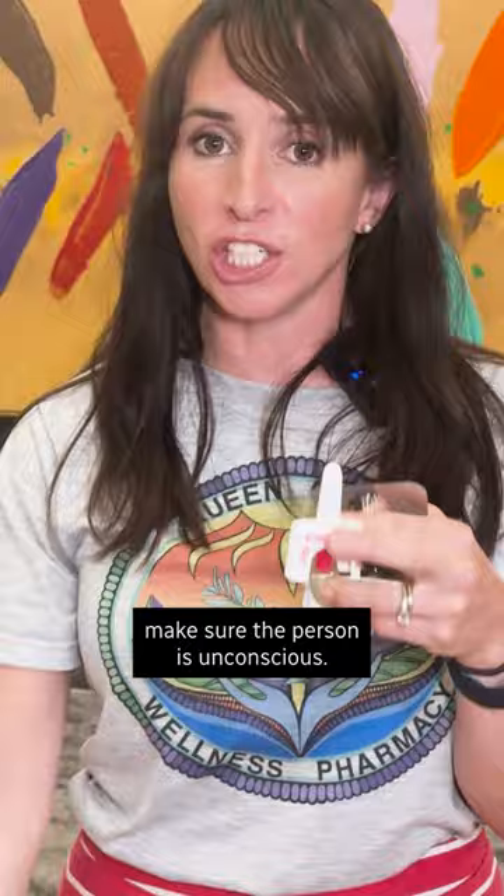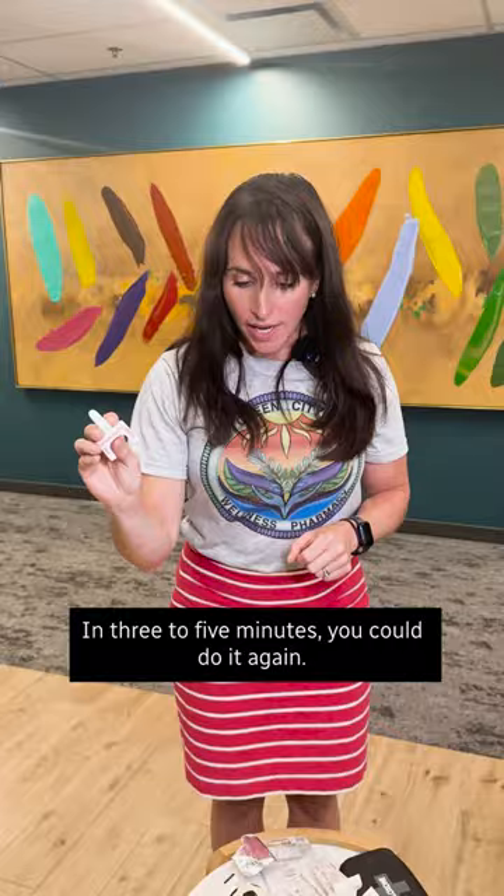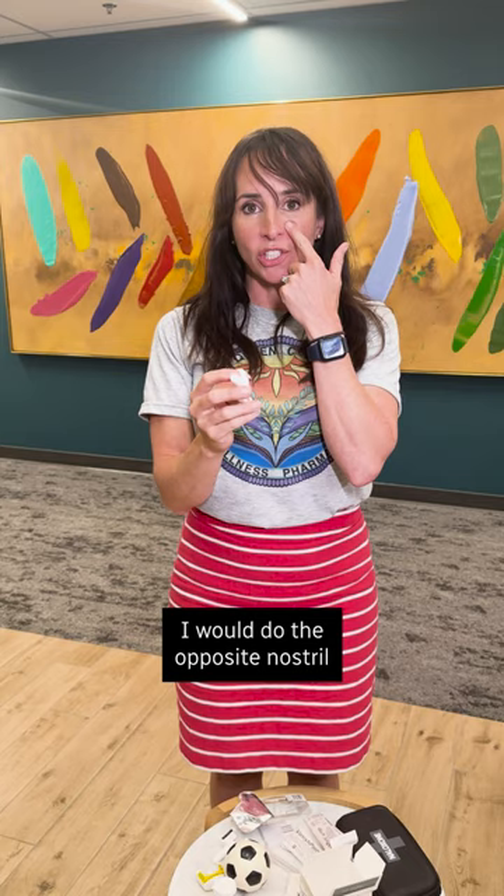Put this in the nostril, push the button, wait a couple seconds and that's it. In three to five minutes you could do it again. I would do the opposite nostril and keep repeating it until EMS arrives.